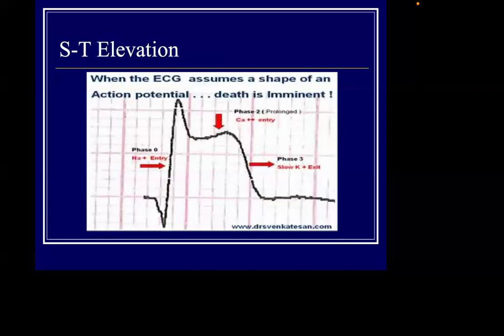So the first is the hyperacute T wave. Then will come the ST segment elevation. You see the hyperacute T wave in minutes from the onset of chest pain and from the onset of the occlusion of the artery. This is why you should keep repeating the ECG for a patient who presented to the casualty with cardiac chest pain. You shouldn't do one ECG and stop, saying the ECG is normal. Actually, the ECG most of the time is normal early on when the patient presents with cardiac chest pain.